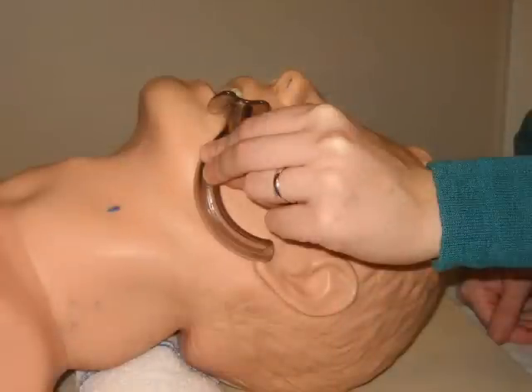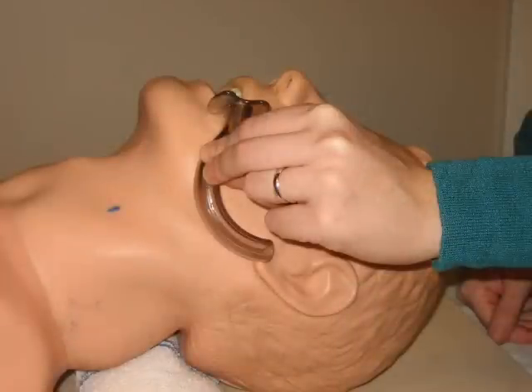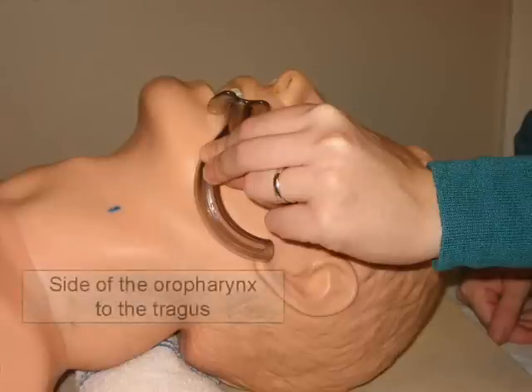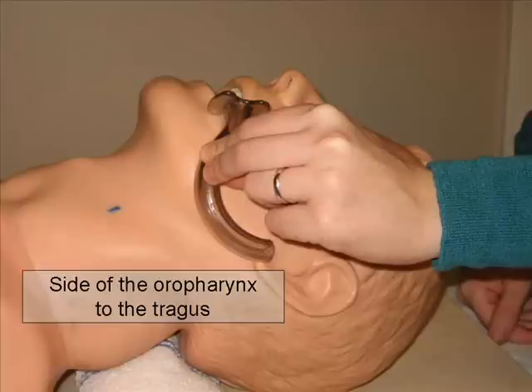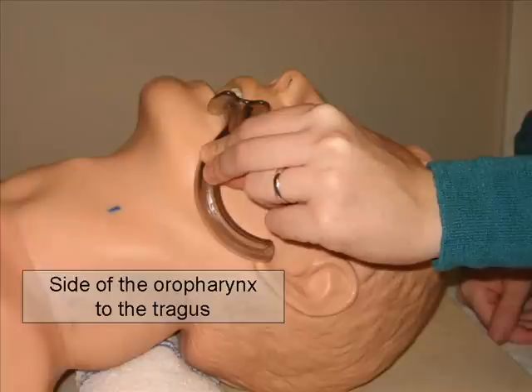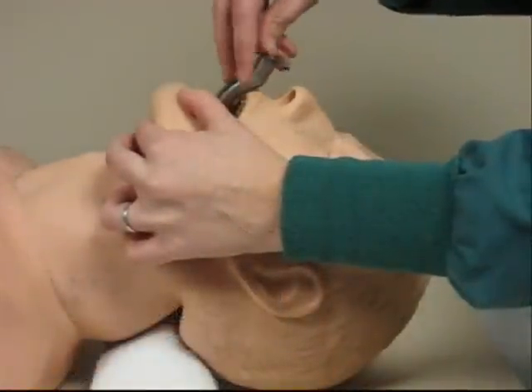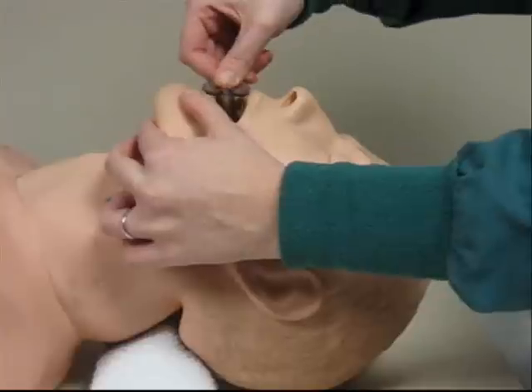Depending on the patient's facial anatomy or the relative state of consciousness, an oropharyngeal airway may need to be used. The individual should demonstrate the relative sizing of the airway as well as insertion technique during the challenging of this competency-based objective.